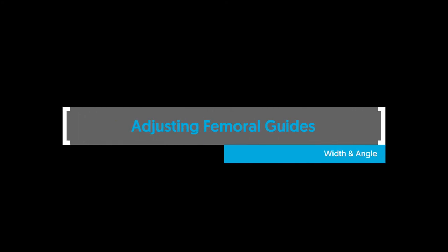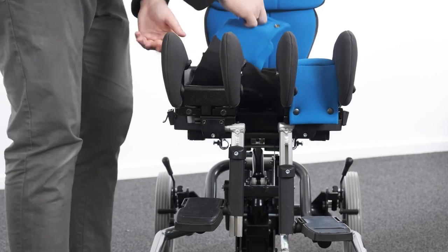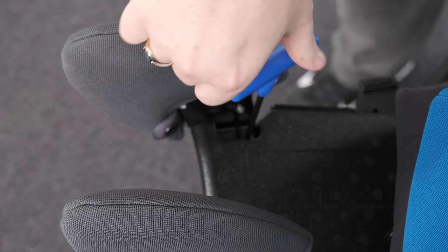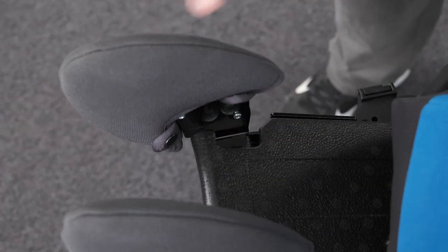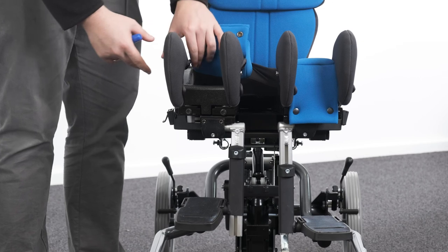Adjusting femoral guides — width and angle. To adjust the width and angle of the femoral guides, lift the seat cushion up at the front to gain access to the bolts. On the basic seat, there are femoral guides on the outside of the seat only. On the split seat, there are four sets of femoral guides. Loosen the bolts and move to the desired position. Tighten to secure in place.